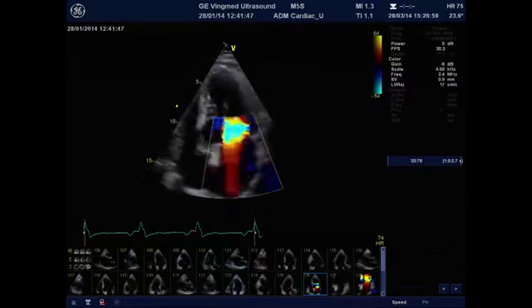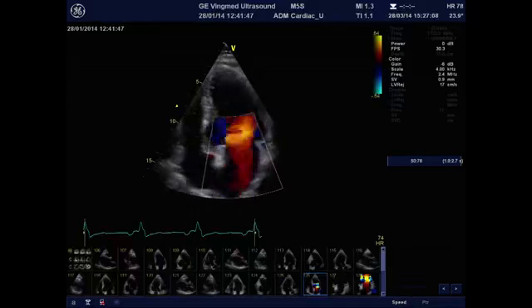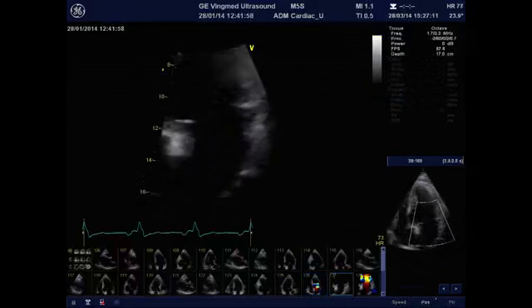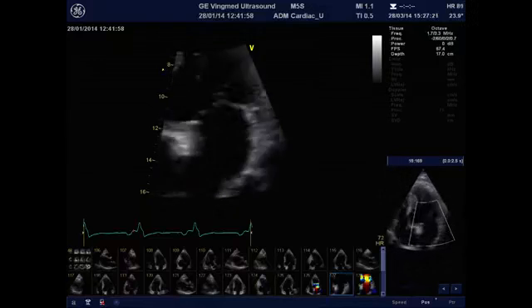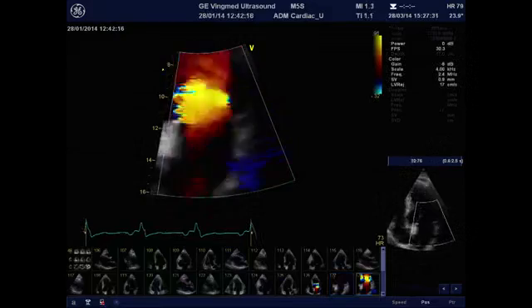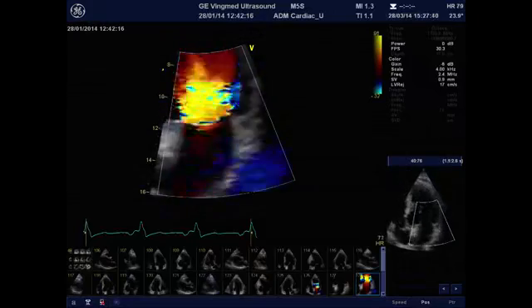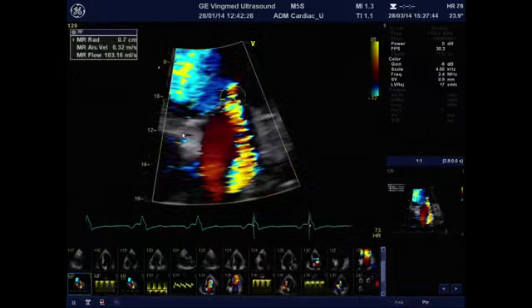So how could we explain the significant dyspnea of the patient? We look at the mitral regurgitant jet, which looks quite similar, and again, not surprisingly, as compared with the examination before revascularization. So we look at the mitral valve. The mitral leaflets are normal. There is some tenting of the leaflets with small motion of the posterior leaflet. And we try to quantify, even if it remains relatively difficult. You see that there is some PISA where I have decreased the aliasing velocity to 32. And we have a PISA radius of 7 millimeter, 0.7 centimeter.